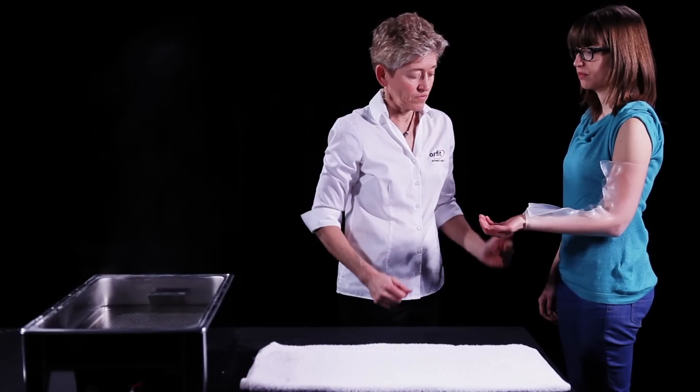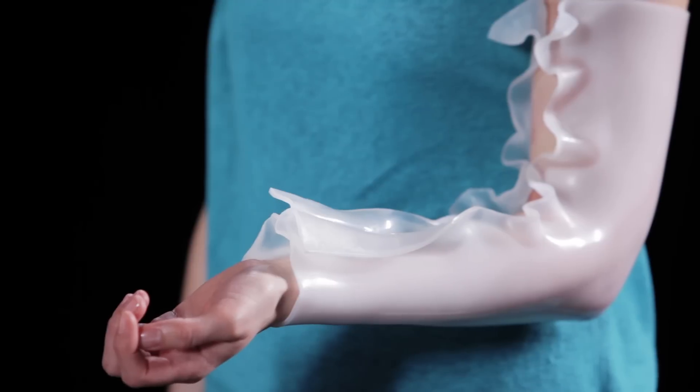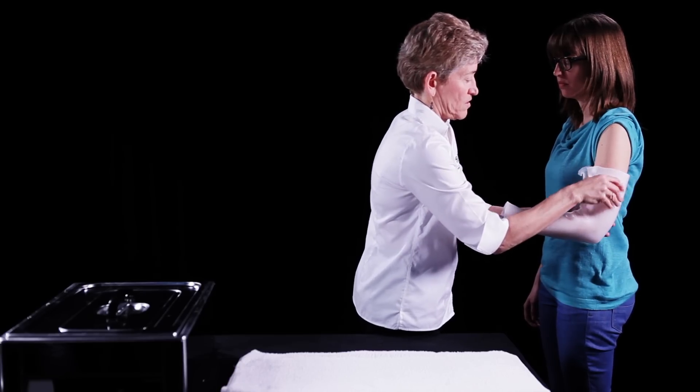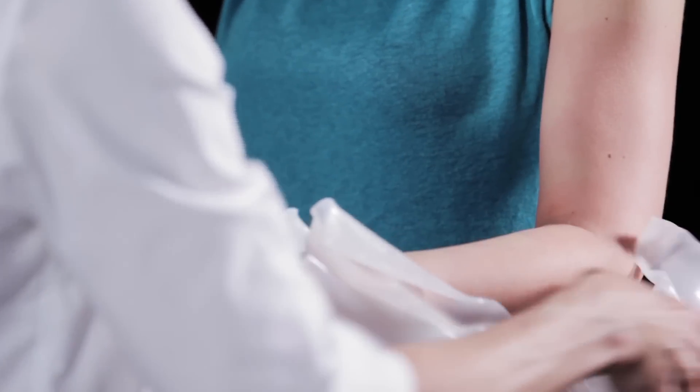Keep the pinches in a relatively straight line. This material will change back to white when it's set. When cooled, the material is easily separated at the pinch marks due to its excellent coating. Pop the pinches apart and remove the orthosis from the patient for trimming.